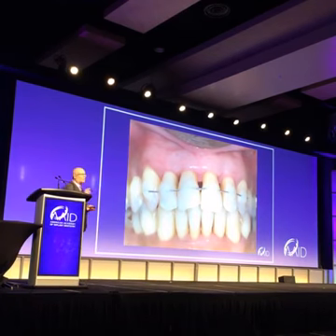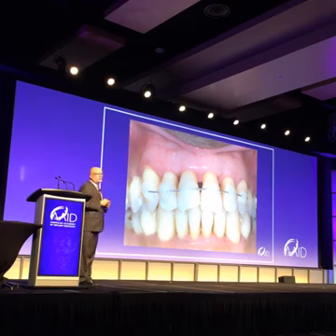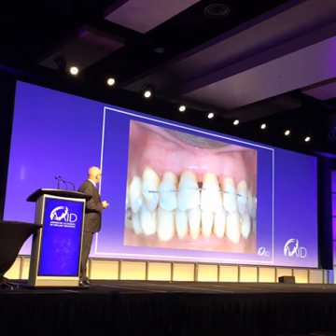And this is what he looked like 4 weeks later. We stabilized his teeth with a stent, with a splint. And look how nice that tissue is. Do we get recession? Yeah, we got some, because of inflammation. But look, the gums look pretty good. They're pretty healthy. And he's able to keep it clean now. And he's happy with it.